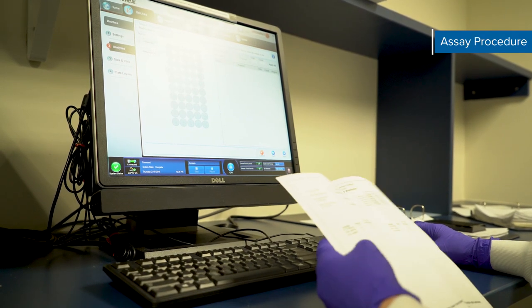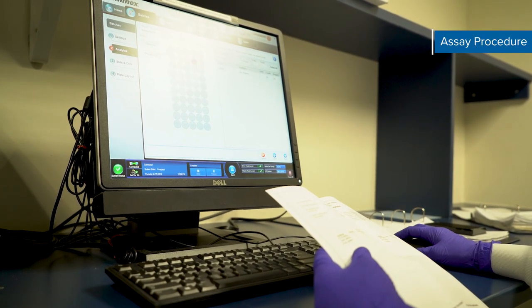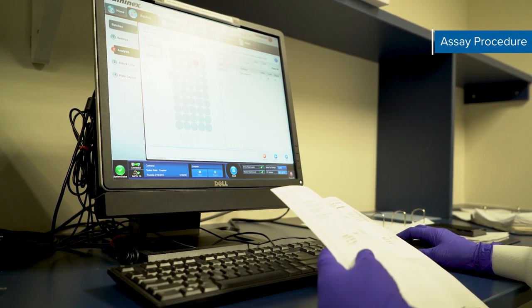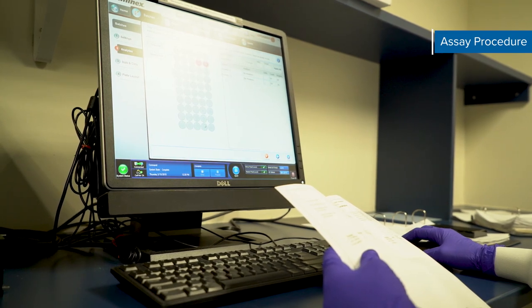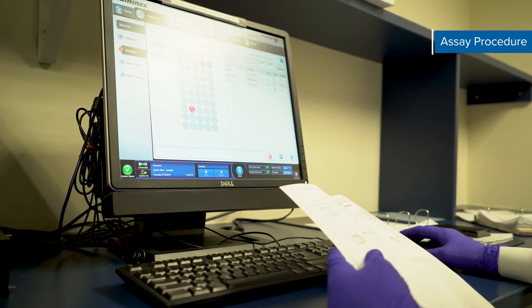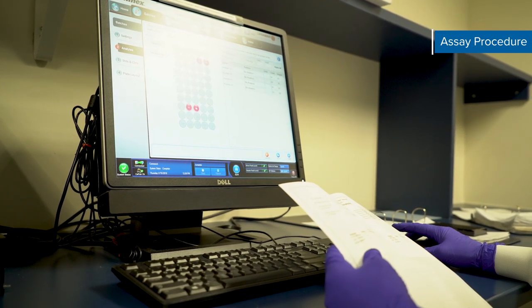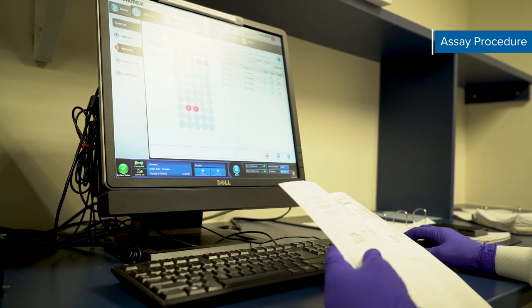While incubating set up your assay protocol on the instrument. For microparticle regions and high standard values refer to the certificate of analysis. For instrument settings refer to your kit booklet. If using a Luminex 100, 200, FlexMap 3D or Bio-Rad BioPlex warm up the laser.